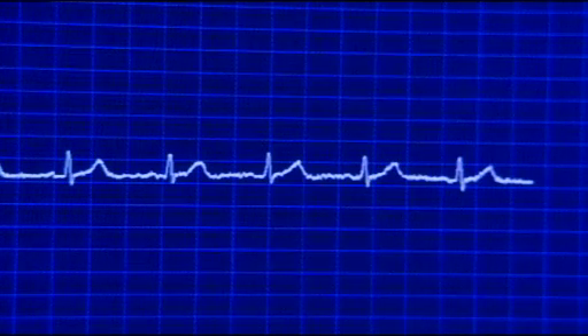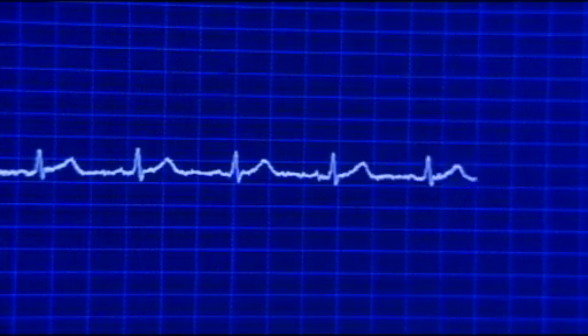On the screen is quite a familiar signal. Many people have had it measured themselves in hospital, or seen it on TV or in films. It's a regular beat that reflects the way that the heart is pumping blood around the body.